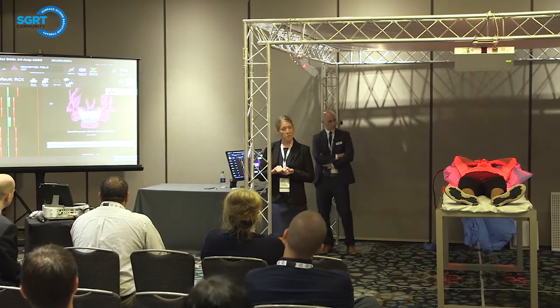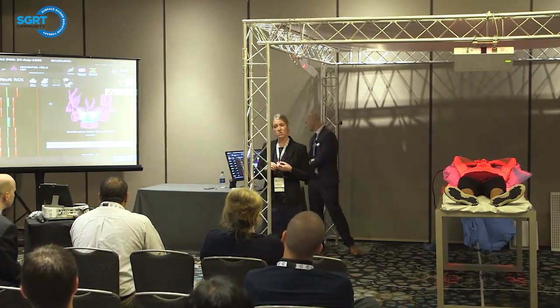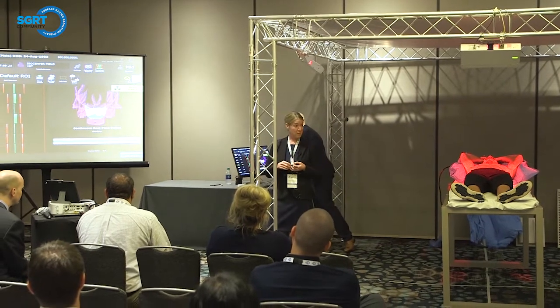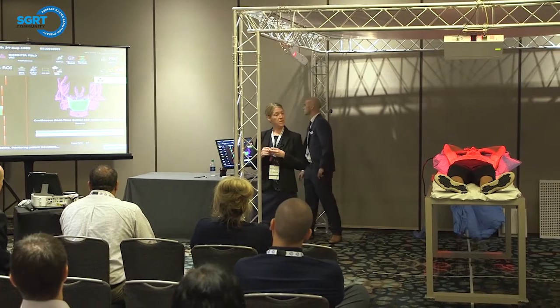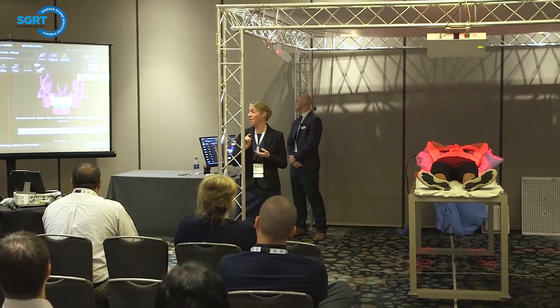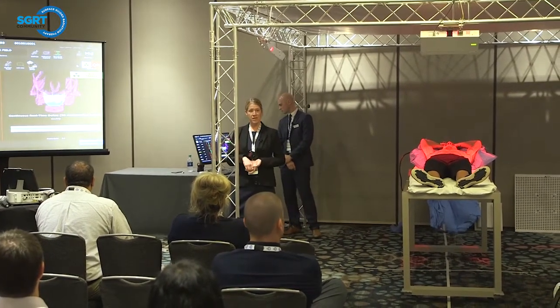And if you have the beam hold capability, if the patient moves outside the thresholds, the beam will be held. And then once our treatment is finished, we're just going to terminate the session. So we're going to pause the monitoring and then close out of treatment mode.